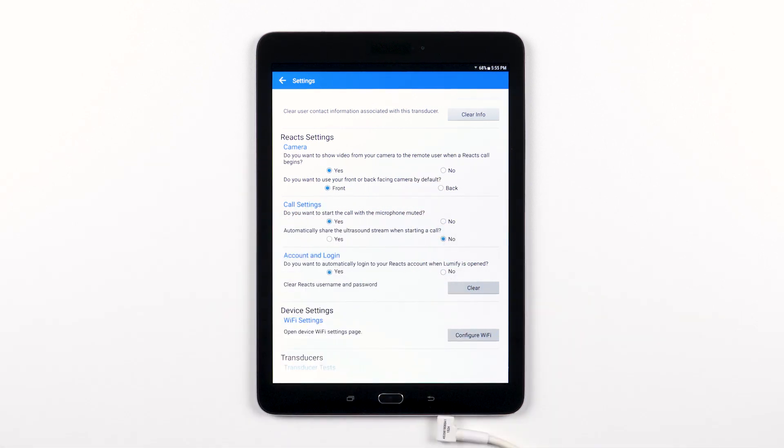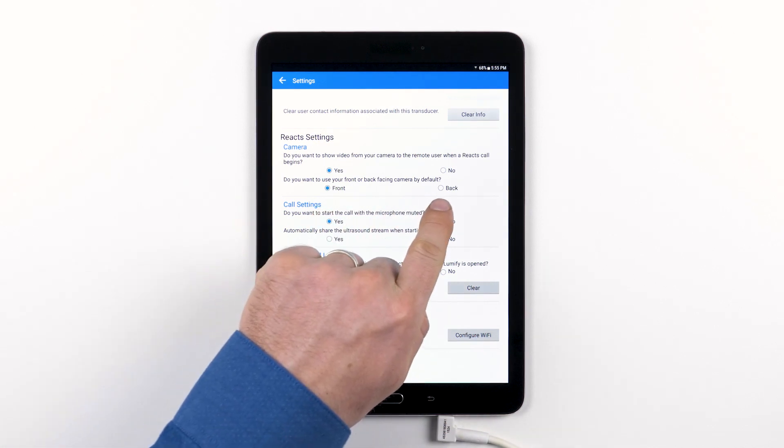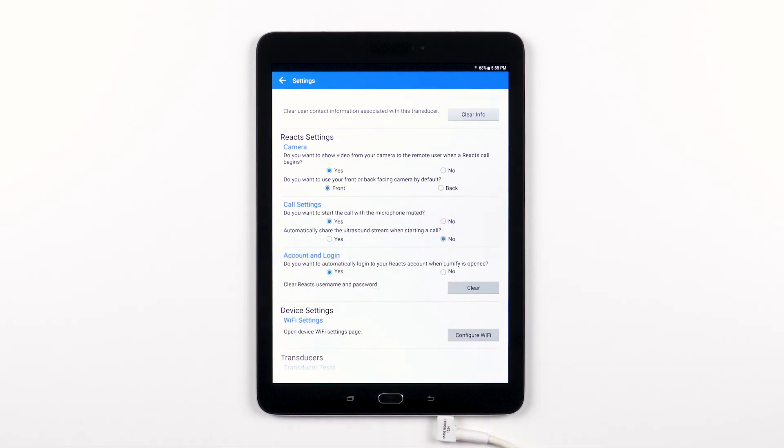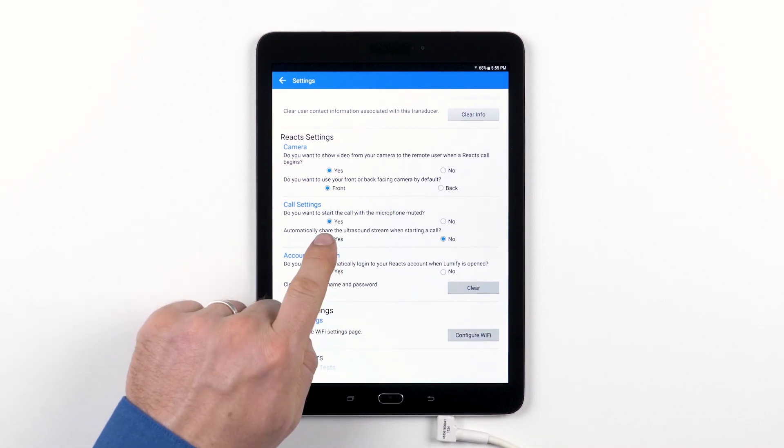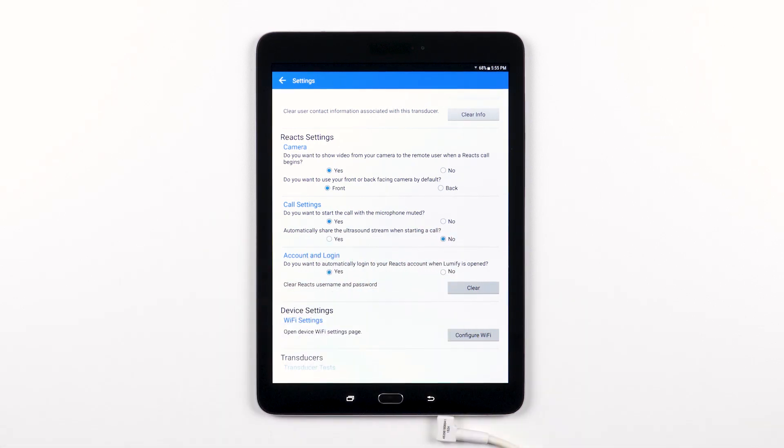If you want either the front or back-facing camera by default, you can choose one or the other. Call settings gives you the option to choose whether or not you want to start the call with the device's microphone muted or if you want it to be active when you first place the call.